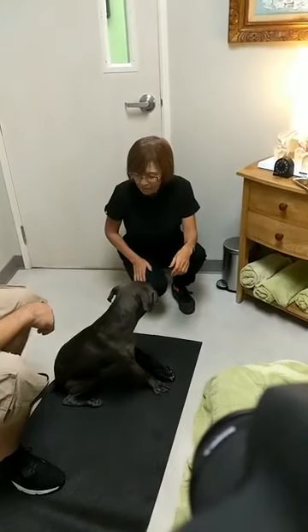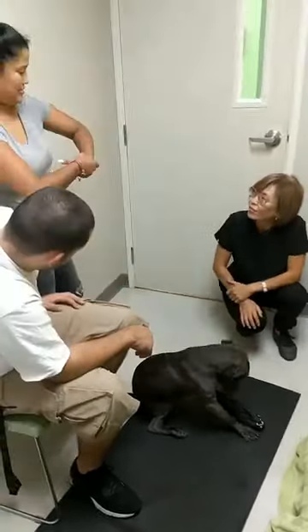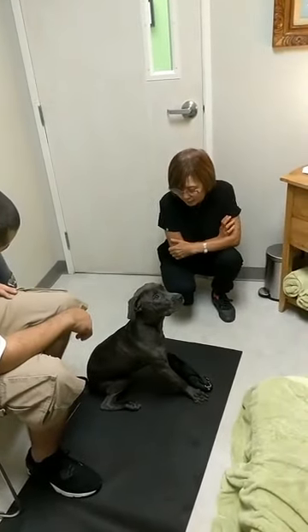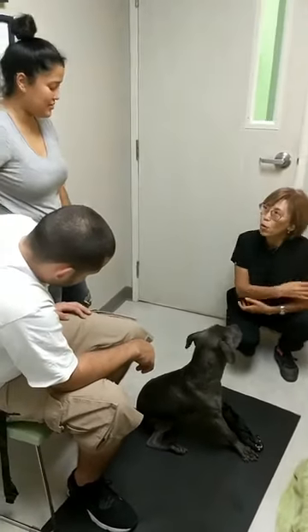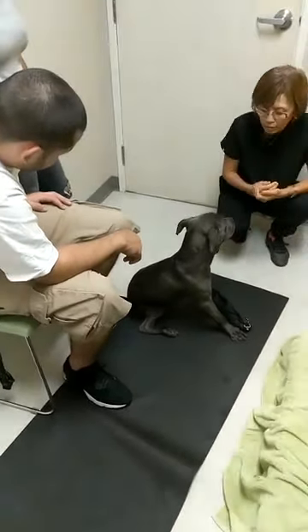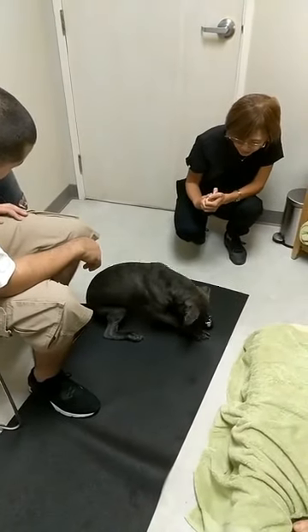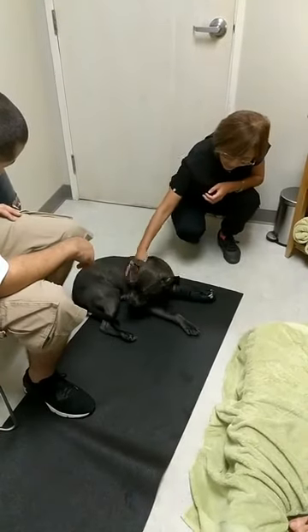He swam! The only part is right here, but he's using it and he swings it. He's doing a lot of circular motion and using more motion in the shoulder area. That's good! Good job — you're so cute. Oh my god, that's a cool looking boot!